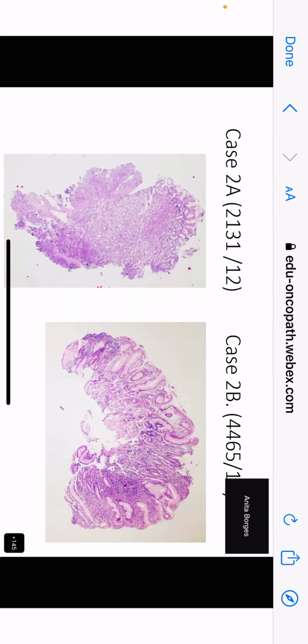Yeah, ma'am, this part. Yes, ma'am. You mean that everything from here to here is the glands? Yes, ma'am. Right. So now, can you tell me if everything is normal here? Do you see any normal mucosa? No, ma'am. All glands don't look alike, ma'am. They don't look alike. Okay.